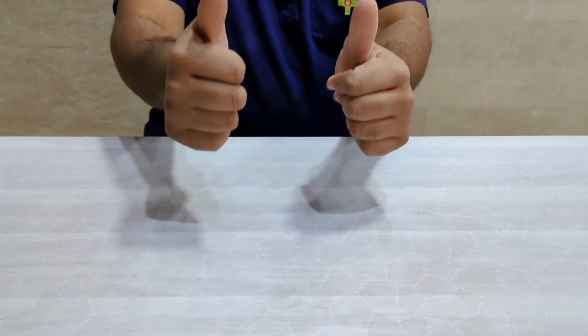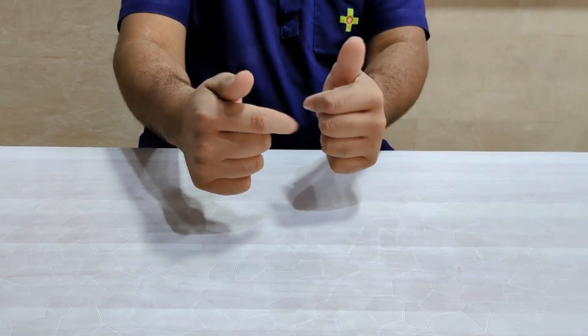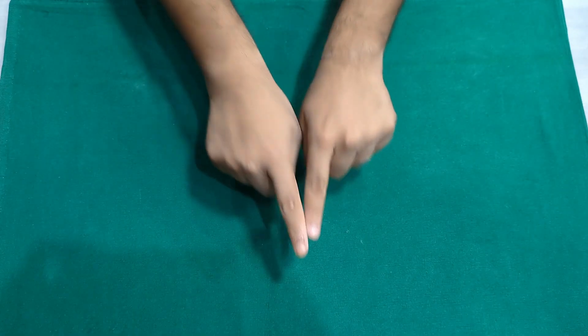This video is made to demonstrate how to put on and take off sterile gloves. Before you touch the package, spread a sterile cloth underneath.